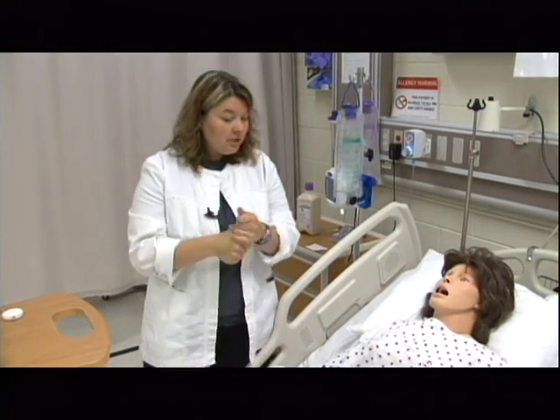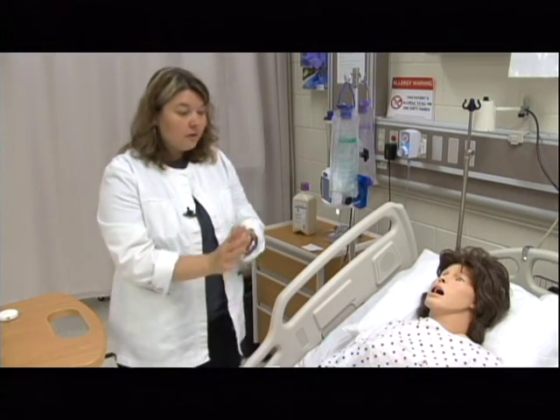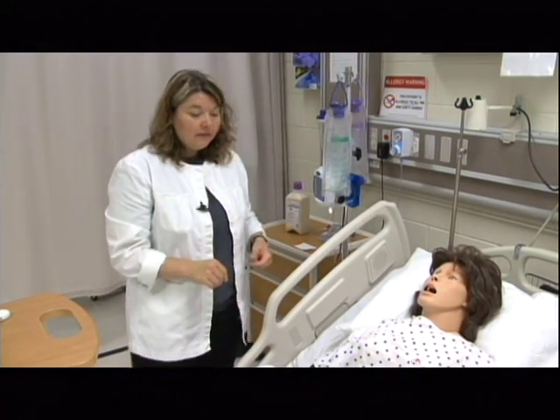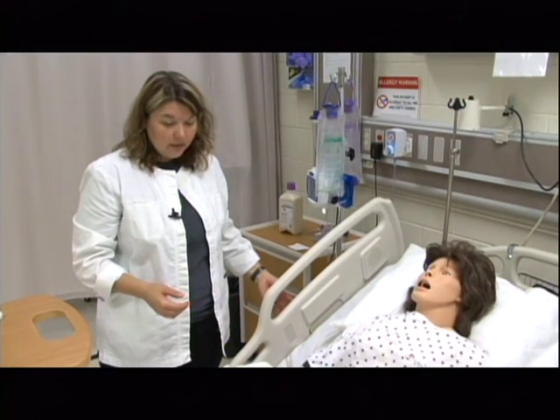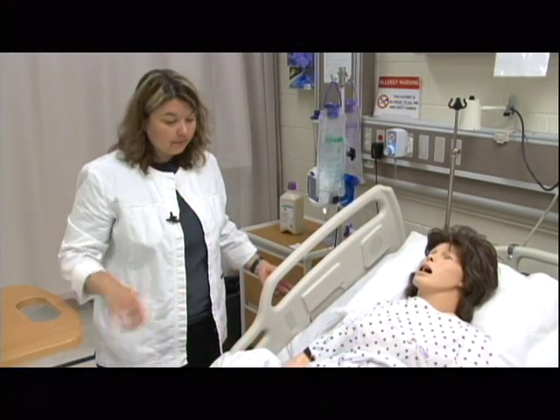Now, as far as positioning of your patient, you need to make sure, of course, always that their bed is locked. And then I need to raise her to my height if that is appropriate, if I need the bed higher. So I'm going to go ahead and do that. Make sure you always save your back.